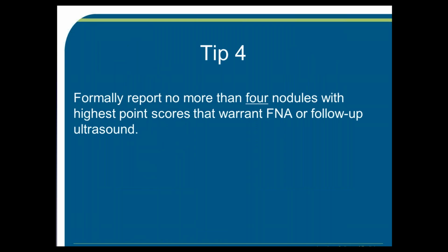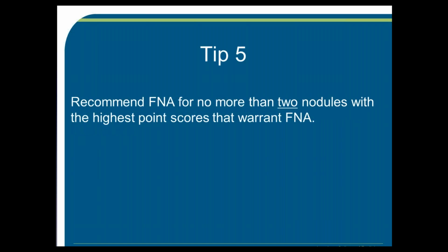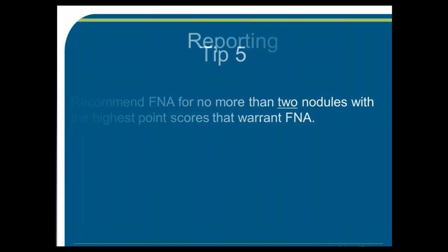Fourth tip, ACR TI-RADS says to formally report no more than 4 nodules with the highest point score that warrant FNA or follow-up ultrasound. You do not have to classify every nodule in the gland. That would be time-consuming and wasteful. Similarly, you can recommend FNA for no more than 2 nodules with the highest point scores that warrant FNA. Now, if you have several nodules that have identical point scores or are in the same TR level, you can decide which one to recommend biopsy on using other criteria sometimes, such as size or where they are located in the gland. But generally, it's not productive to do a biopsy of more than 2 nodules in a given gland.